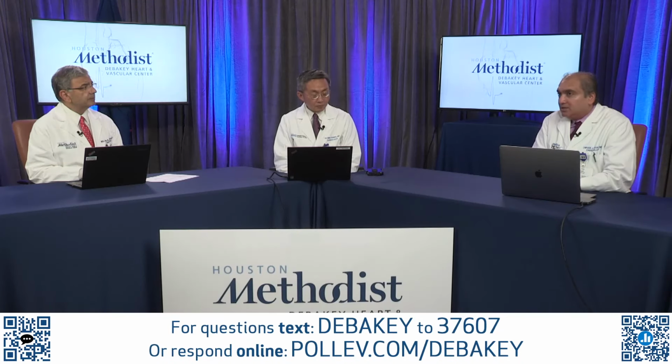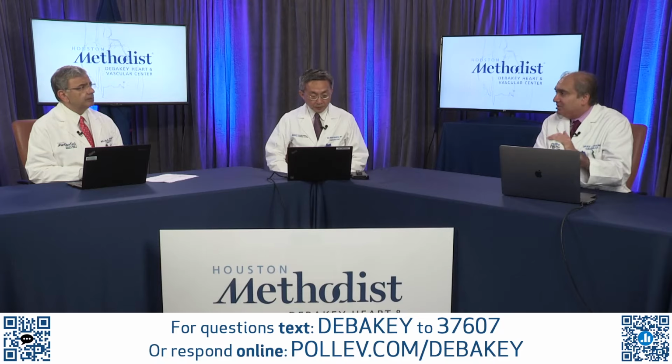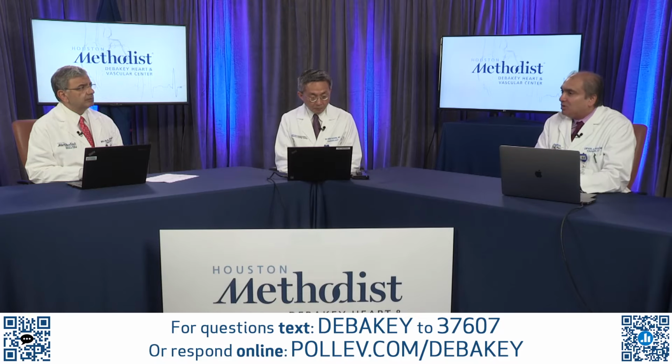I think that the nice thing about regurgitation is that for most of the methods that we utilize, we don't need to image directly at the valve itself. We're actually imaging at a location different to that to determine the regurgitant volume. And in addition to that, you obviously get the information about remodeling of the ventricle, which again is going to be very important from a timing standpoint of when you're going to think about doing something for these patients.